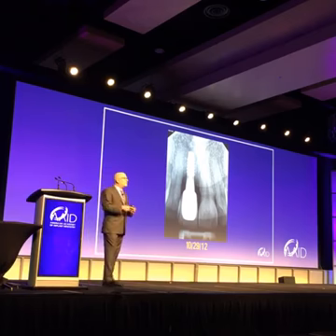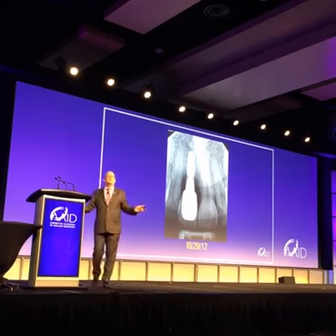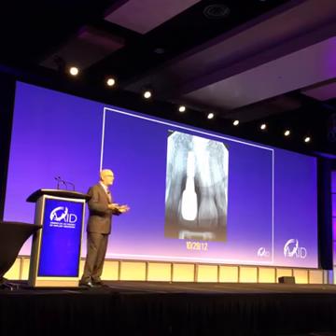Aesthetics. If you start flapping things open in an anterior case and degranulating and everything else, things start collapsing. And for a person with a high smile line, this could be a major problem. What do you do? Well, we'll take the implant out and start again.